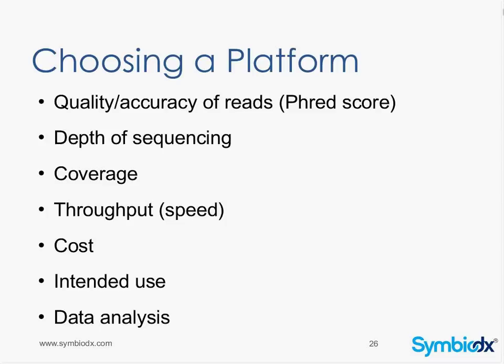You want to look at everything that you intend to cover and make sure that you have adequate depth of sequencing in every single area, because if you're testing for things, particularly clinically, you want to make sure that you can return a valid result for everything that you're looking at. This is actually another strength of the MiSeq panel, that there is more uniform depth of coverage across what you're testing, but again, most of these methodologies are getting to be fairly similar.